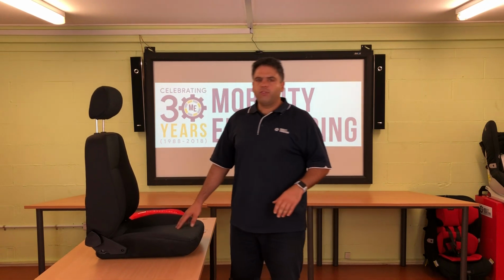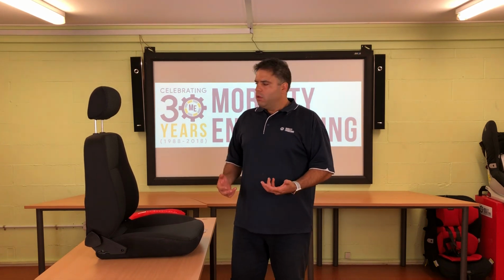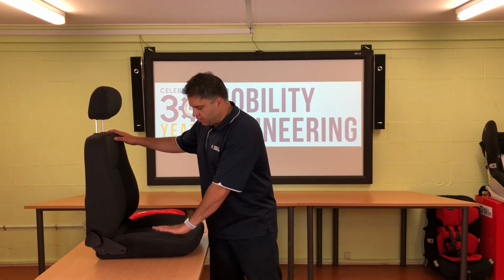So, what's the issue and can you tilt? First of all, from a legal point of view, a road rules point of view and a design point of view, just like a normal car seat like this one here has a tilt function, so may a wheelchair, and that's fine, and there is actually nothing wrong with it. In the laws and regulations around design and road rules and all of the laws that we've looked at, there is nothing that's stopping you from doing tilt.